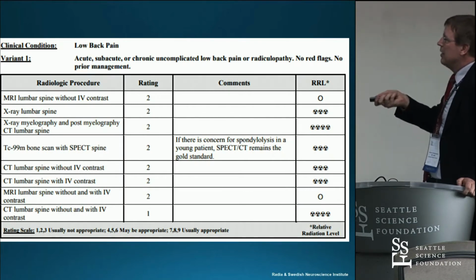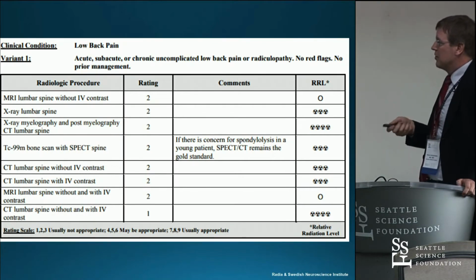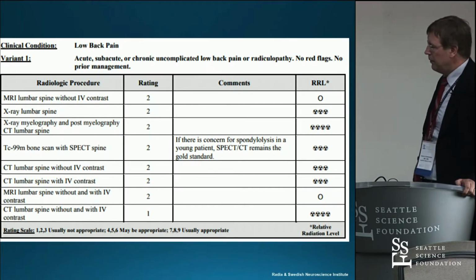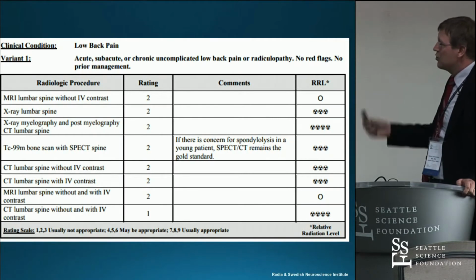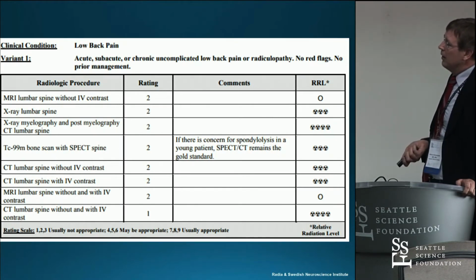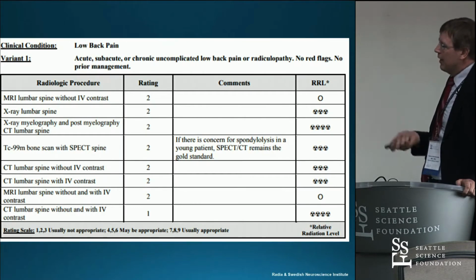Then there's some comments, and then the radiation level, because one thing we have to remember is that a lot of our studies have this side effect of radiation that you have to keep in mind. So, for example, in this case, we have a low back pain clinical condition, basically no red flags, and in the next slide I show you some of the red flags.